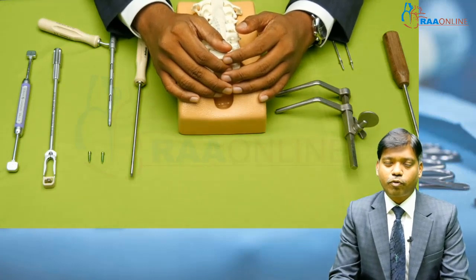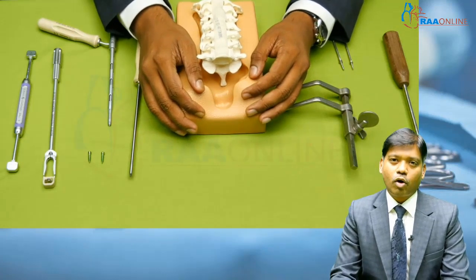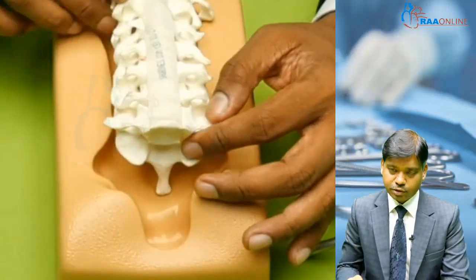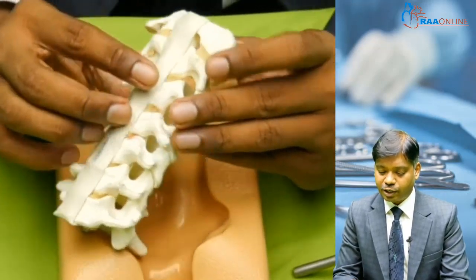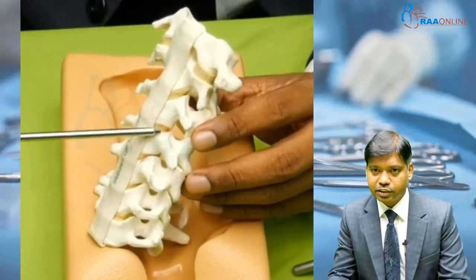So the commonly performed procedure is called the ACDF, or anterior cervical discectomy and fusion, or ACCF, which is called anterior cervical corpectomy and fusion. ACDF means, as you know, this is the cervical spine. In this cervical spine you have the vertebrae, and in between each vertebra you have what is called the disc. So this is the cervical disc.